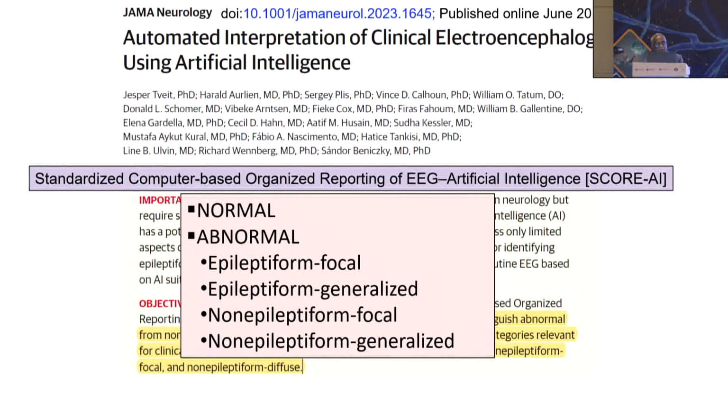Still, these kinds of algorithms can shorten the time of reading the EEG, and you can spend more time identifying and analyzing the waveform than going through it page by page, by correctly identifying certain pages on which you have to spend the time. But they can never replace us. This should be considered an adjunct and not a replacement for the EEG reading.